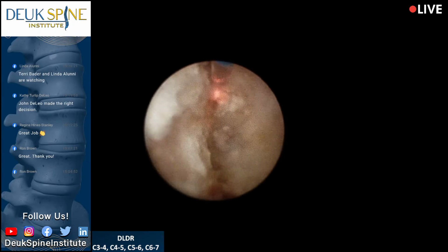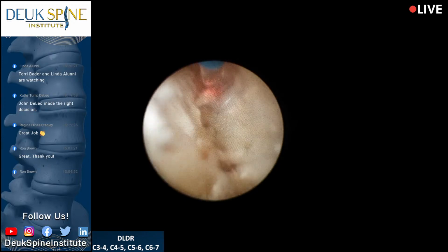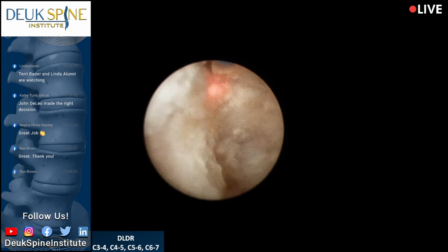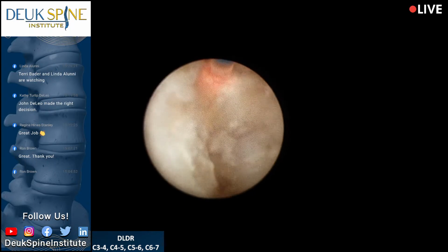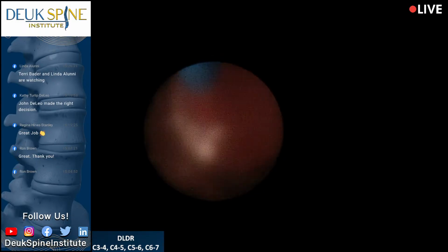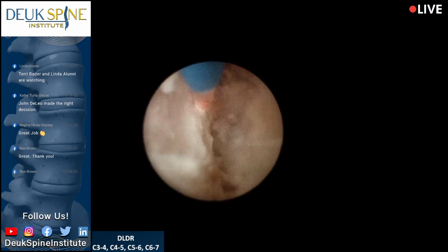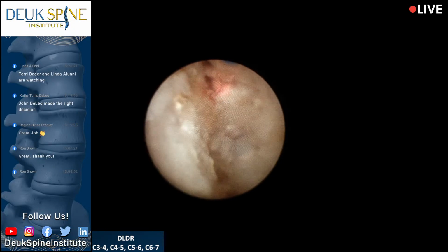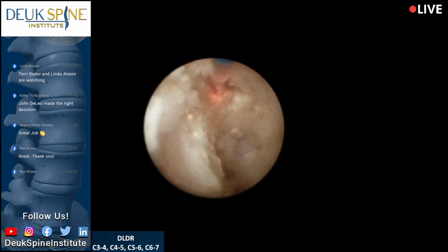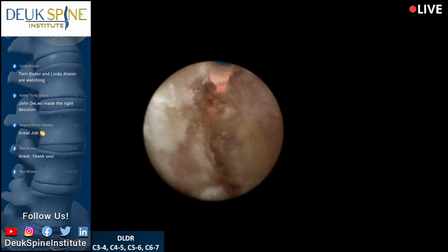We're going to be done in a few minutes, folks, so it's been a long case, and I appreciate all of you guys sticking around for it. I think he'll be happy with the results. I really do. I think we've accomplished a lot here. You can actually see movement now. It wasn't there before, and I'm happy with the progress we've made. That's the foramen. It's looking good.